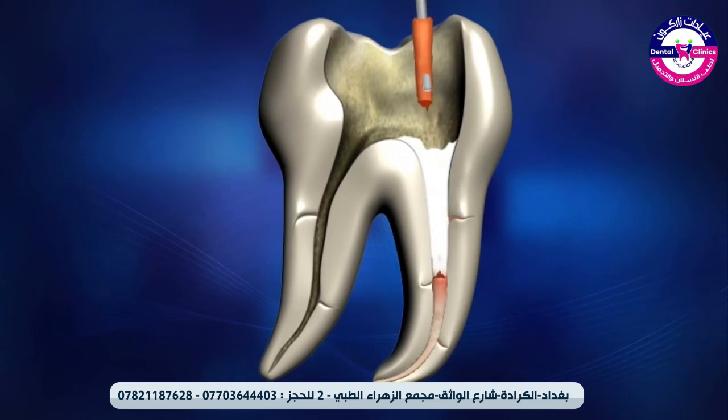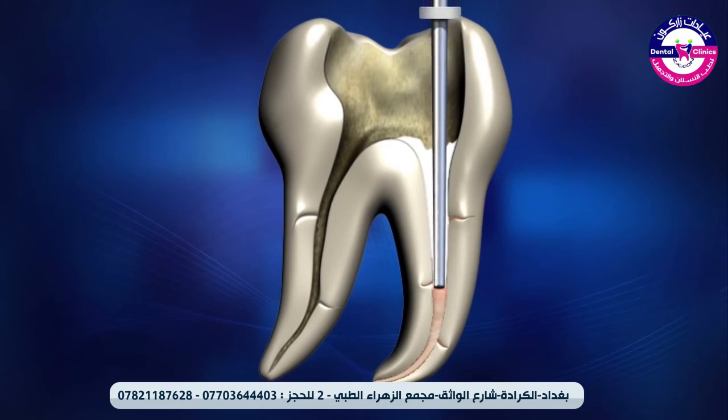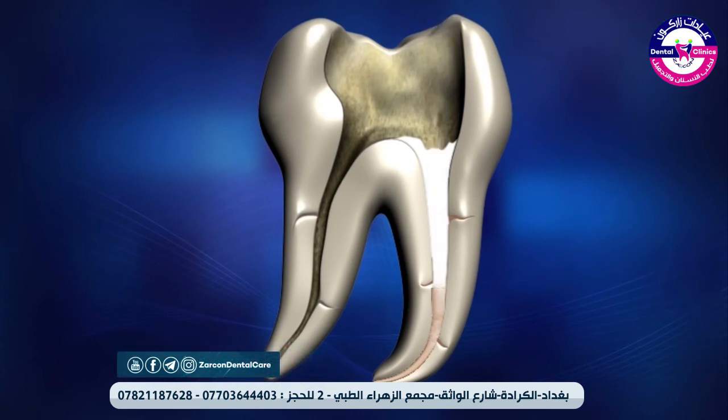The tip will carry and remove the coronal mass of gutta percha, leaving the apical plug and sealed lateral and accessory canals. Use the hand plugger to condense the remaining gutta percha material.